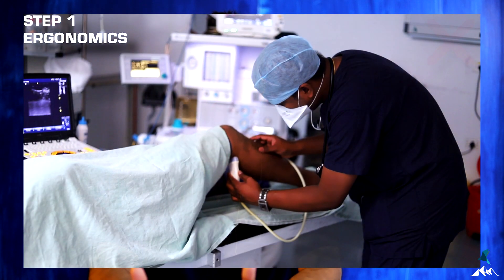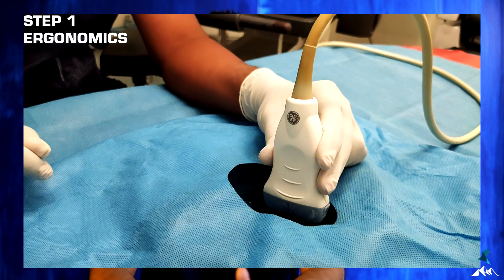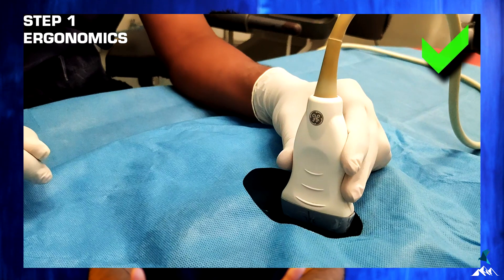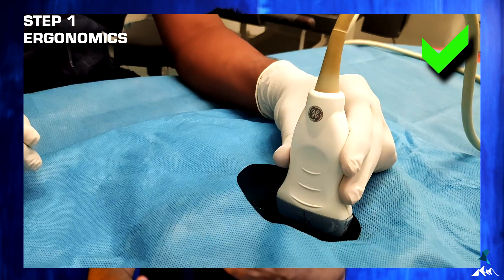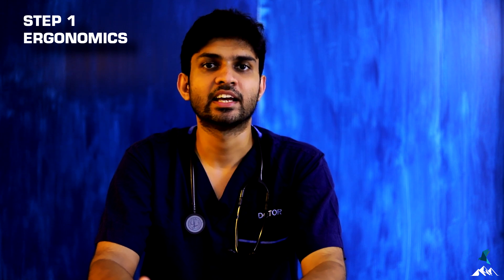Second in ergonomics: try to do the procedure in a sitting position so that you can be comfortable. For the hands, rest the ulnar aspect of your hand over the patient or any surface so that the hand holding the probe can be held easily and you can make fine movements without getting fatigued.